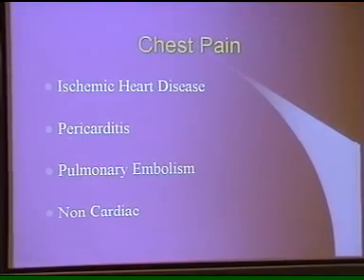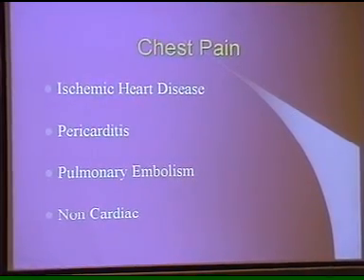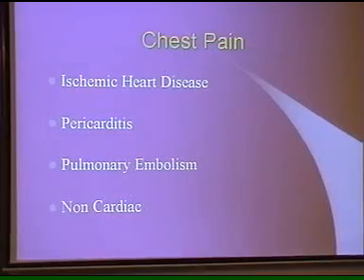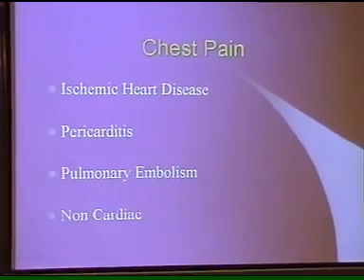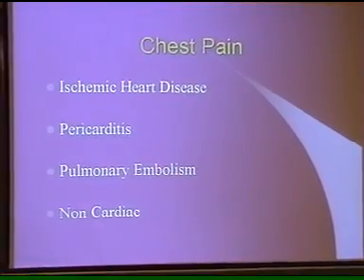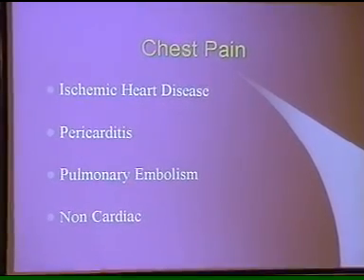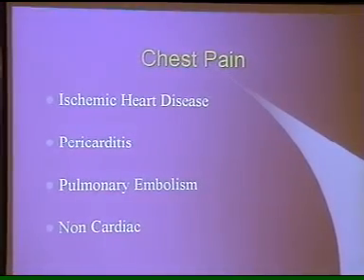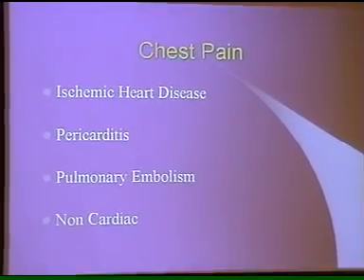In chest pain, we are basically concerned whether a person has got ischemic heart disease or whether it's a pericarditis or a pulmonary embolism or one of those many other causes of chest pain which are non-cardiac and non-pulmonary. And this is an area where ECG is particularly helpful and easily available these days.